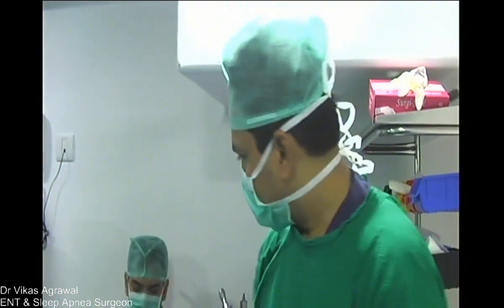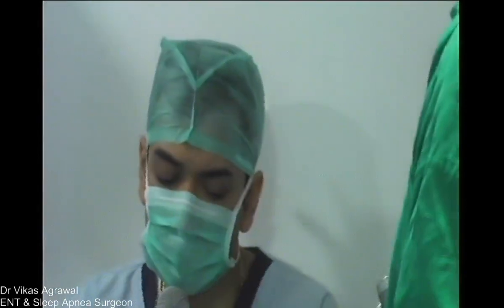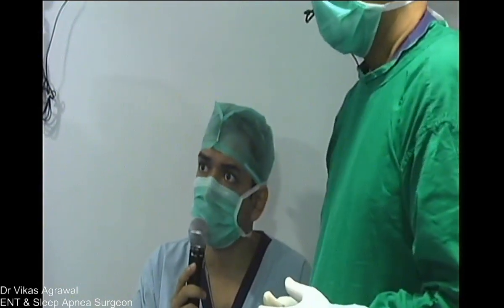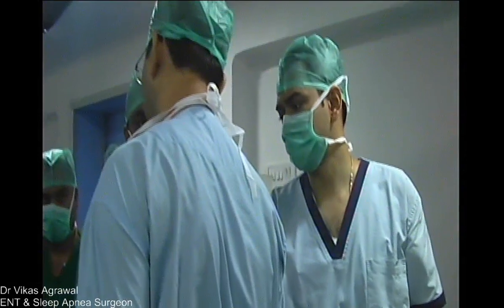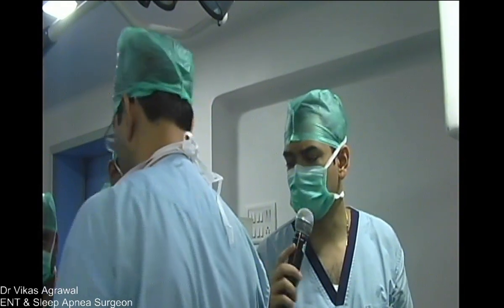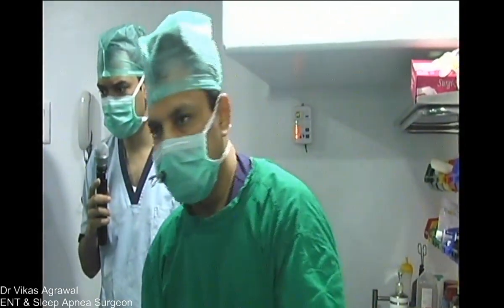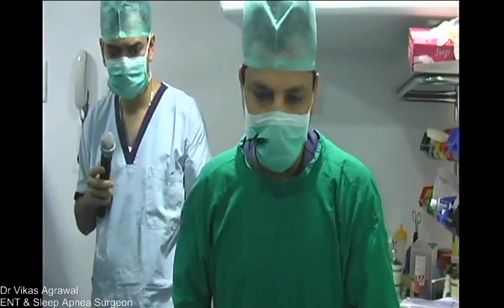So there are a couple of questions. Are these leads disposable for the BIS? The ones that you use, yes, Dr. Kalpesh? They are single use, disposable. What is the estimated cost? 1,000 rupees. Okay, so it's not very costly. Yeah, right. It's not just 1,000 rupees; you know that your patient is correctly sedated, correctly anesthetized, and is out of anesthesia before you extubate him.